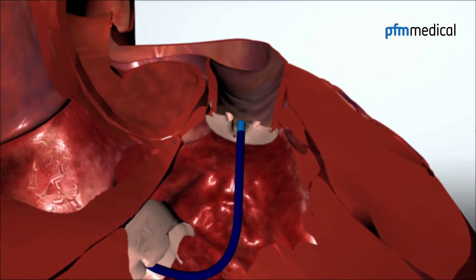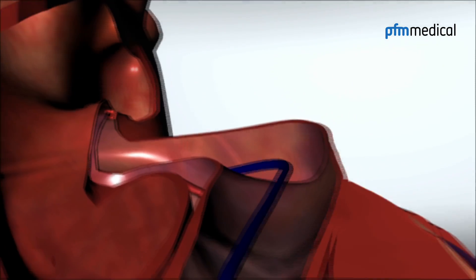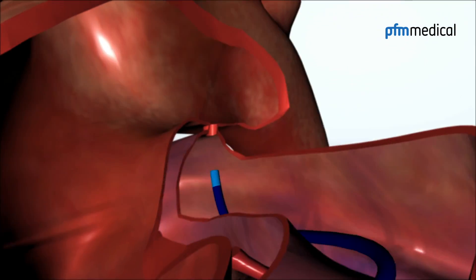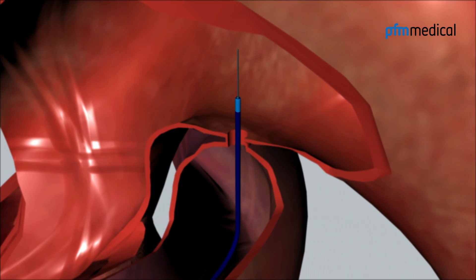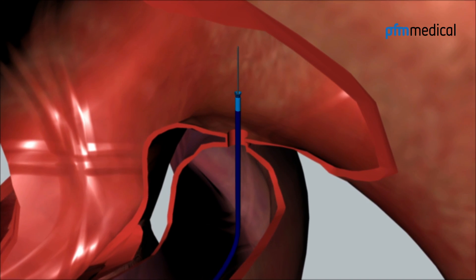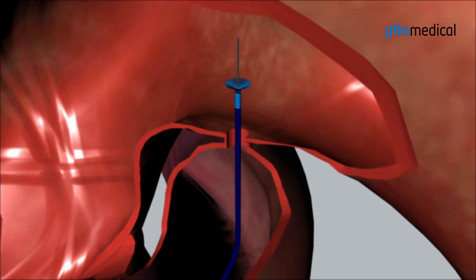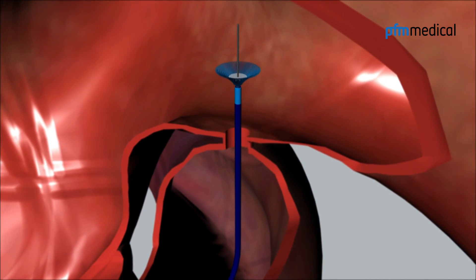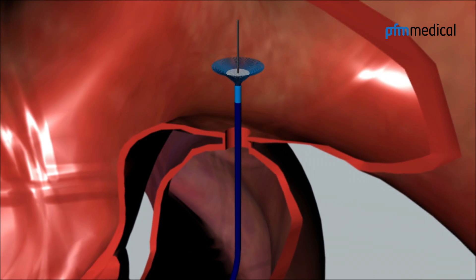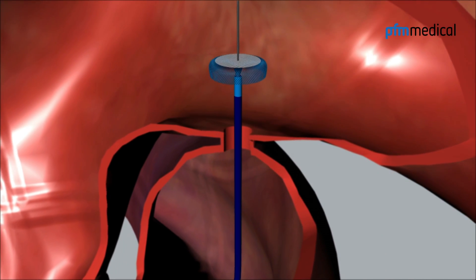An implantation sheath is advanced from the pulmonary artery through the defect and placed in the descending aorta. The occluder is advanced to the distal end of the implantation sheath. The distal disc expands slowly inside the aorta, and the unique configuration of the reverse part of the distal disc can be seen.